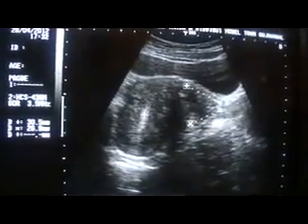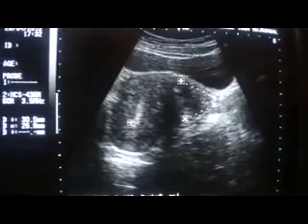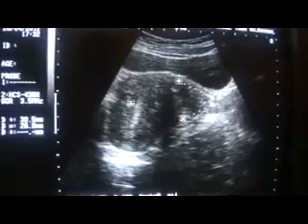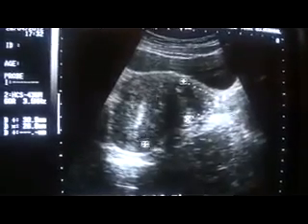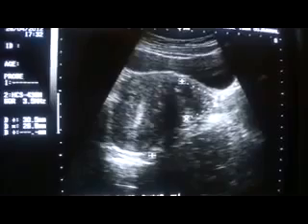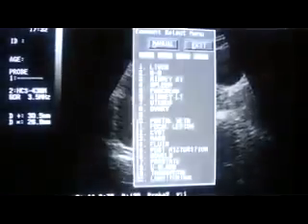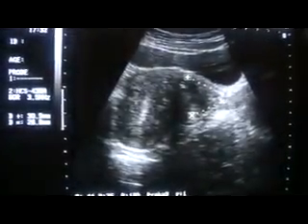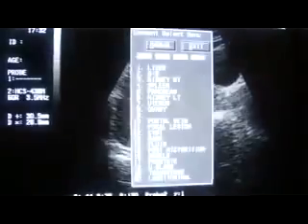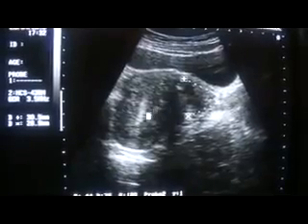Now in such a uterus, when you move the probe 90 degrees and try to scan in transverse section, this area, most of the people who are not fully trained in ultrasonography will call this area a fibroid or a focal lesion or a mass in the uterus, as you can see.